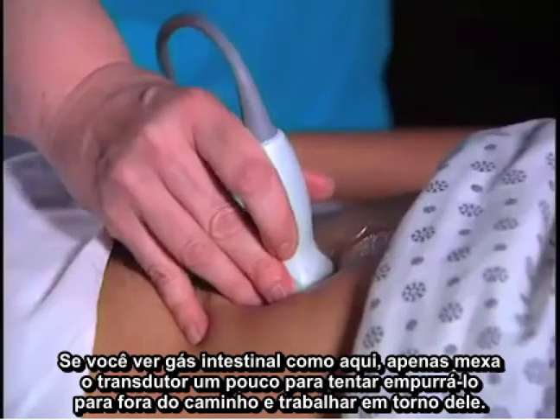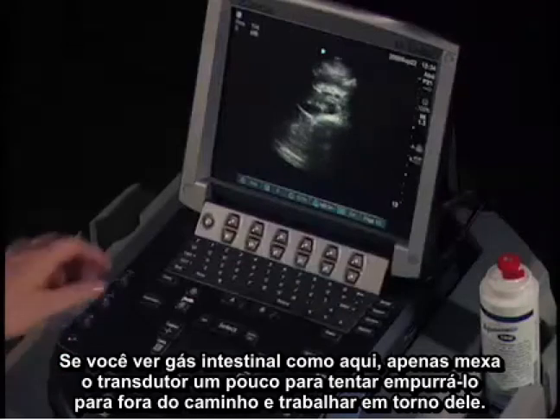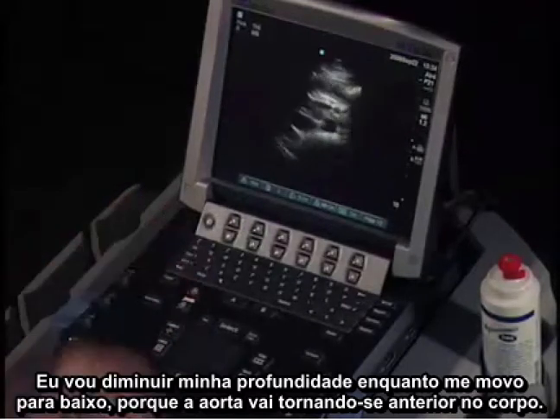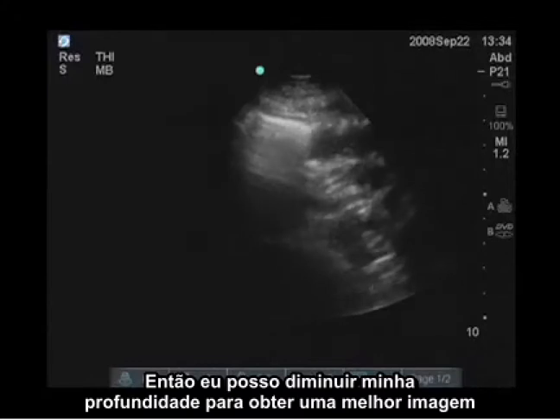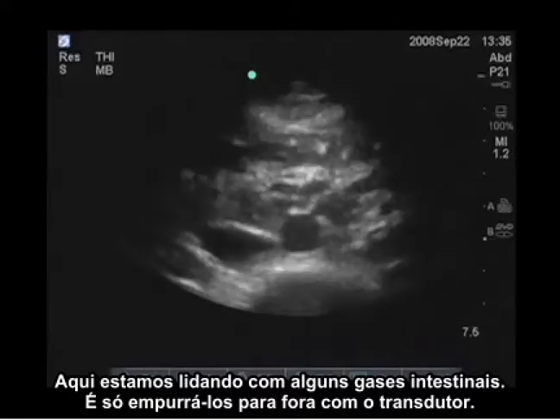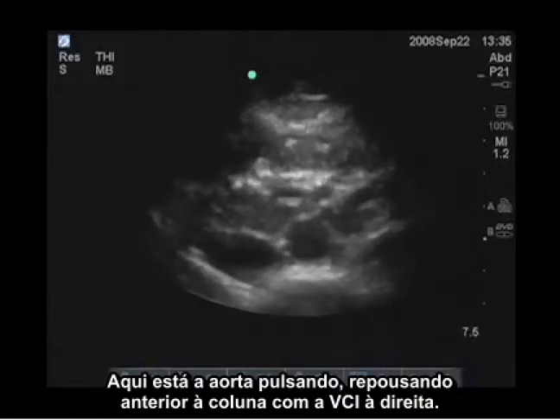If you see bowel gas like this, just wiggle the transducer a little bit to try to push it out of the way and work around it. And I'm going to decrease my depth as I move inferior, because the aorta is going to move anterior in the body. So I can decrease my depth to get it into better view. Again, we're dealing with some bowel gas here. I just push it away with the transducer, and here's the aorta pulsating, just sitting anterior to the spine with the IVC to the right.